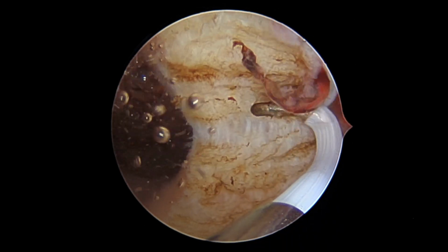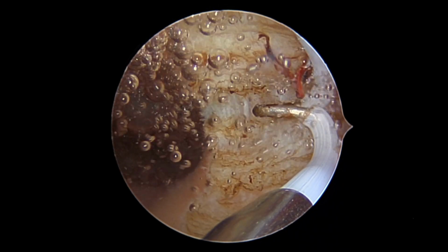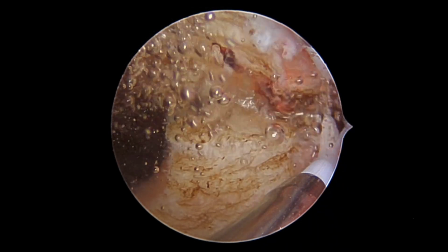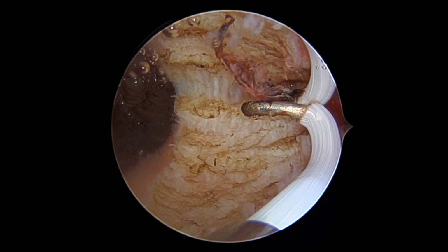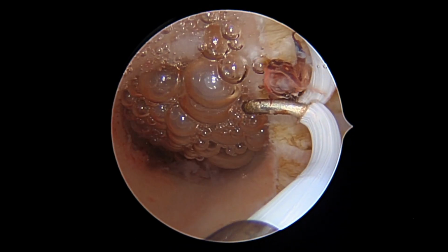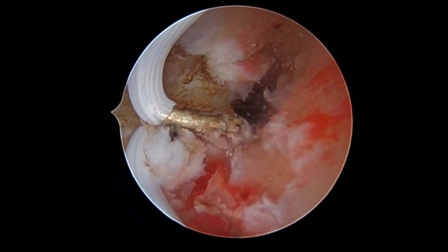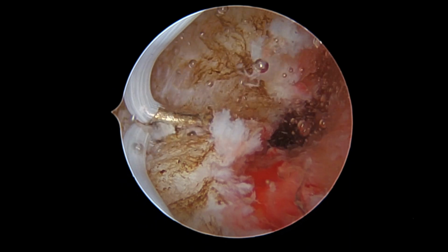A speculum and vulsellum tenaculum are placed to facilitate access to the cervix. We used a 22 French resectoscope, so the cervix was dilated to a Hegar of 8 mm. The aim is to dilate the cervix enough to allow insertion of the resectoscope while keeping a tight seal around it to avoid any fluid leakage.